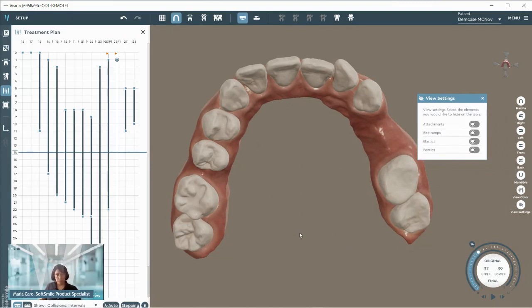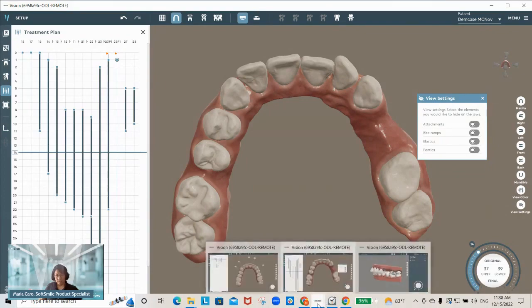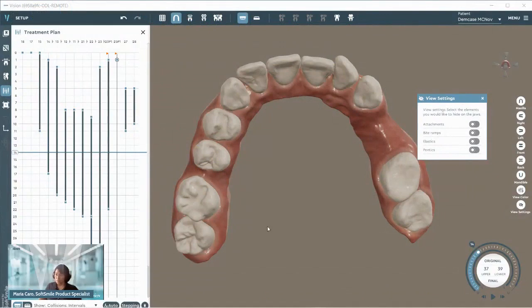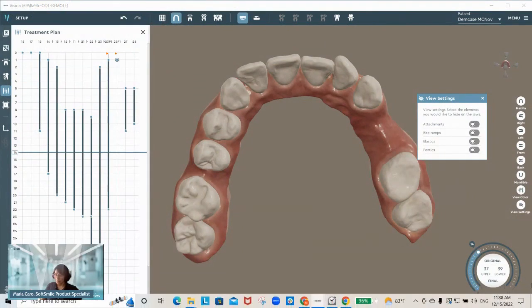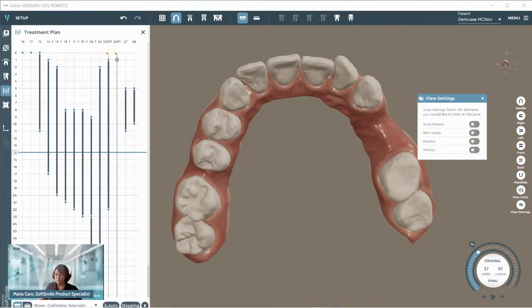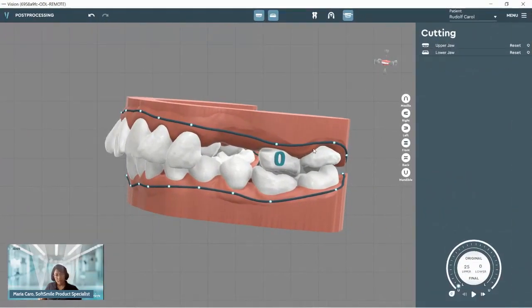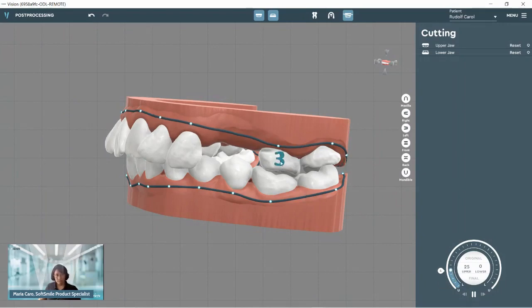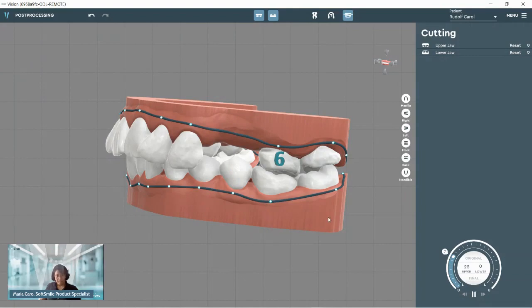I'm going to present another case here to show the option for digits, which allows us to label our aligners and models. Clicking play, you'll be able to see that automatically during an export, the teeth labels and trimming line will appear. This is in the post-processing stage. And I think that will wrap it up for today on my end — I'll hand it back to Kamzat to answer some of your questions.